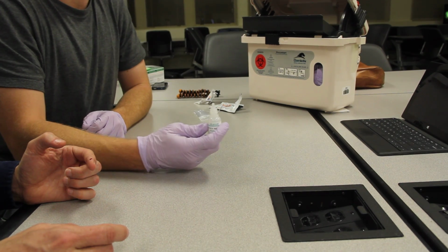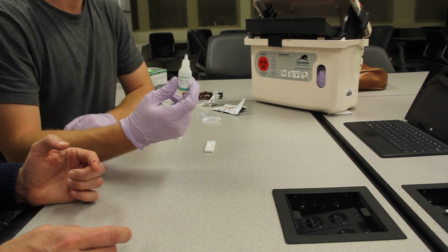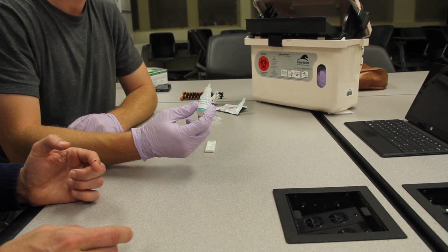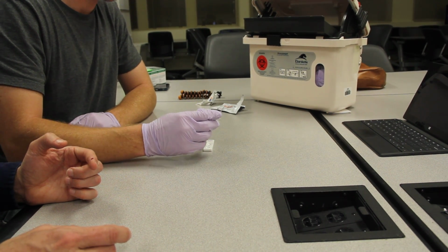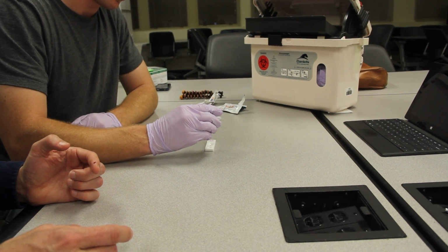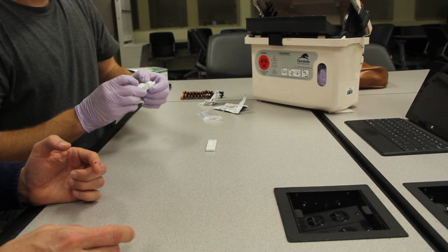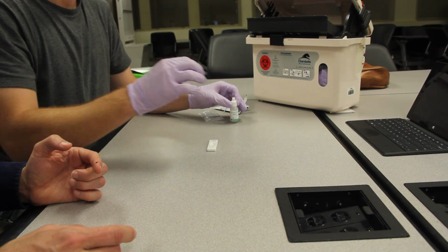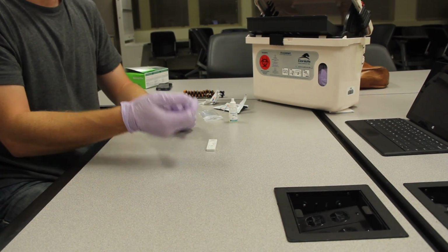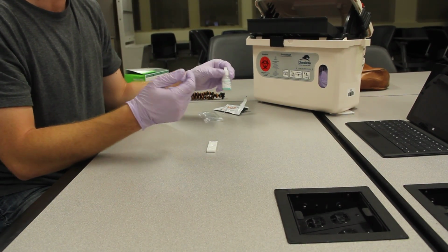The next step is to add a number of drops of buffer. The number of drops actually varies between tests, so make sure that you read the directions to know how many to add. This test you have to add 4, so there's 1, 2, 3, and 4. And when you're adding the buffer, you want to make sure that the drops are falling freely instead of still touching the bottle when you release them. That's to make sure that any potential contaminant in the buffer well doesn't travel up into the container itself.